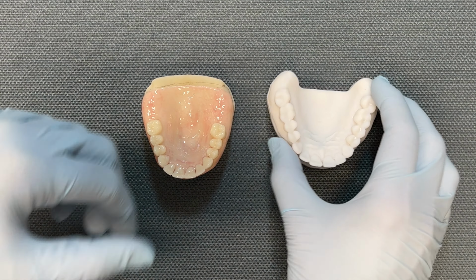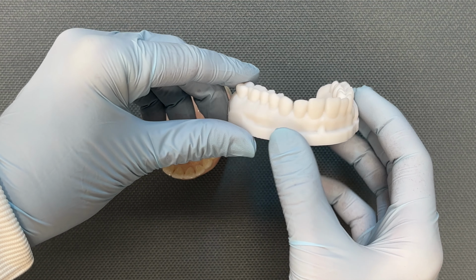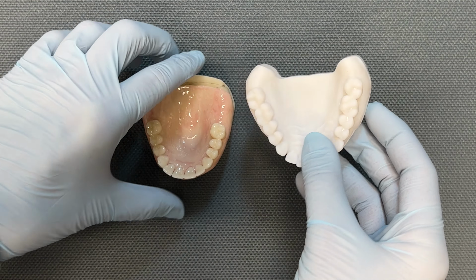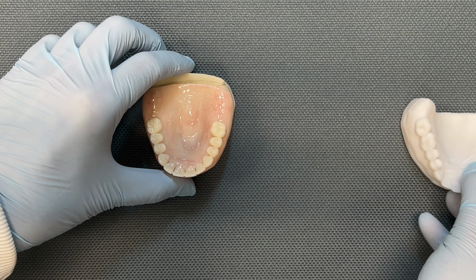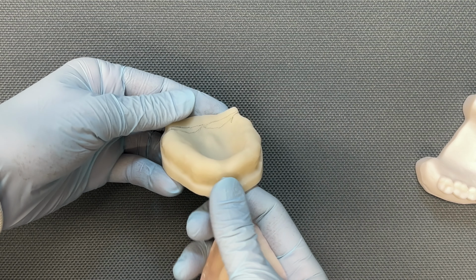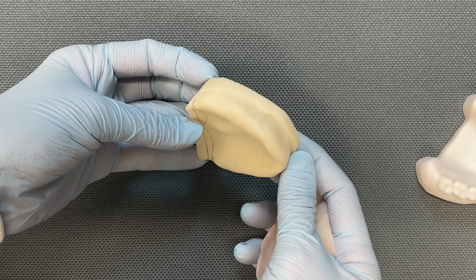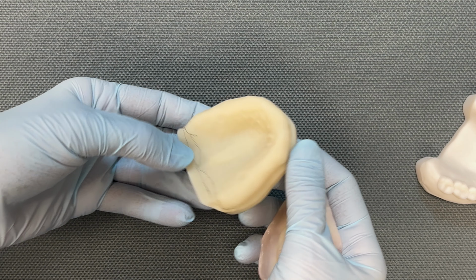So this is actually my mouth here. We got a digital scan. And then we're just going to imagine that we took all the teeth out. And then we've got this ridge here to work with. So that's a nice healthy ridge, something for a denture to sit on.